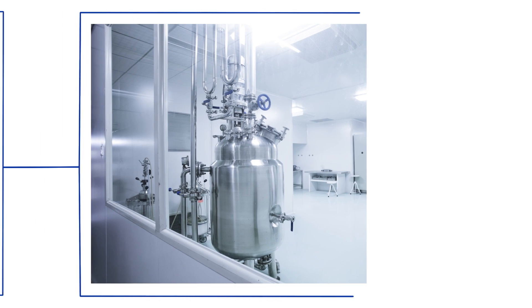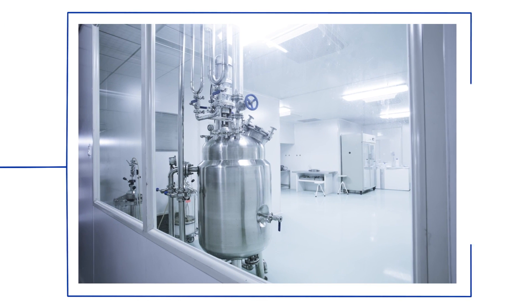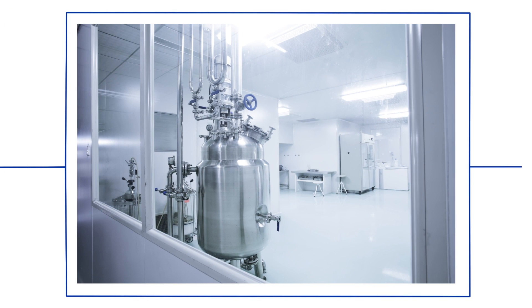The decontamination of large multi-room aseptic production environments can be a complex undertaking when production schedules are tight and downtime is limited.